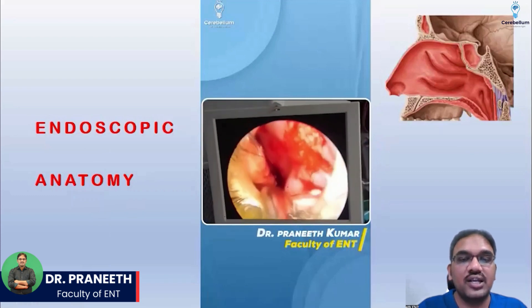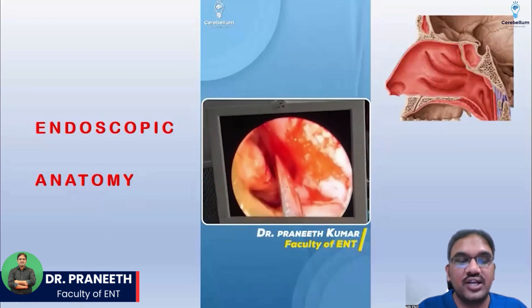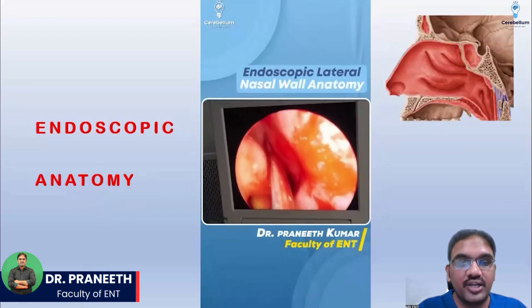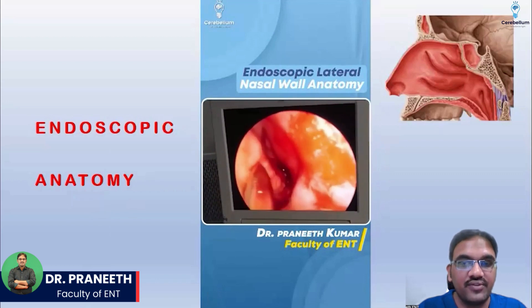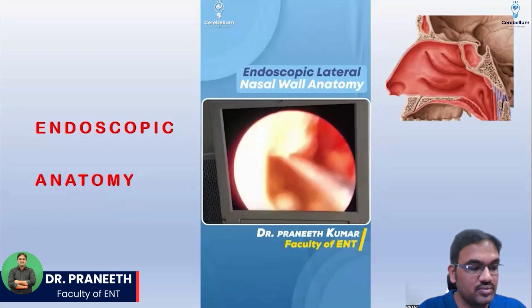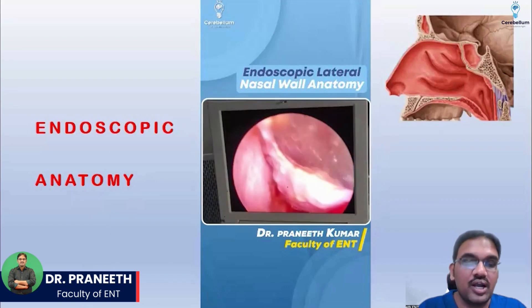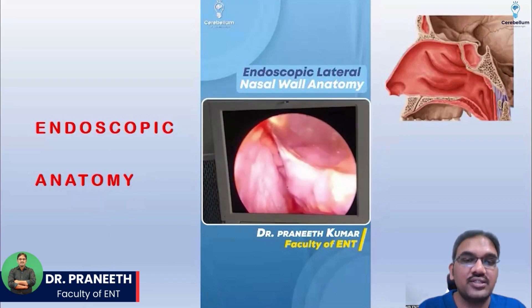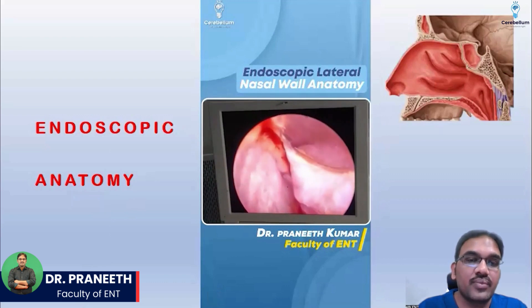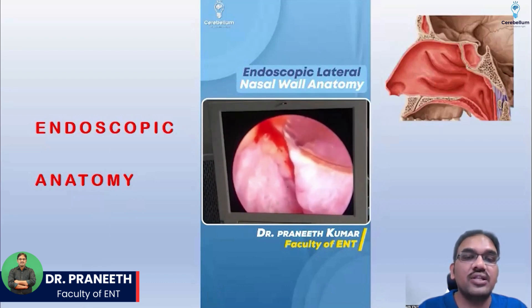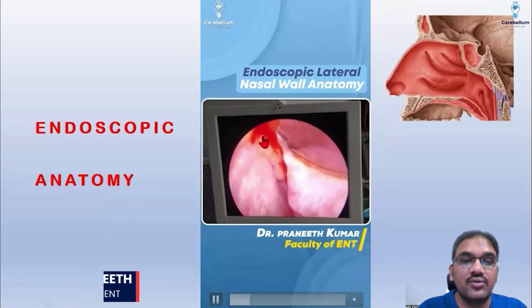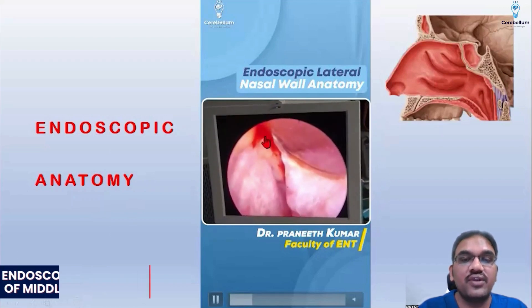As I am entering the nasal cavity, straight below you can see the inferior turbinate. And under it is the inferior meatus, where your nasolacrimal Hasner's valve is present — the teardrop you can see here. So that is your Hasner's valve area.